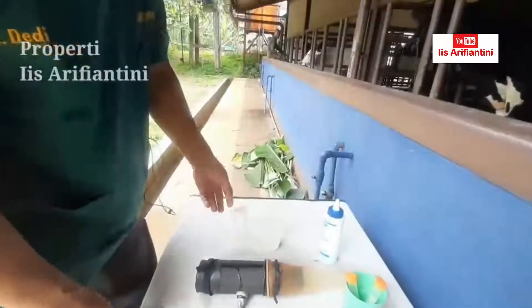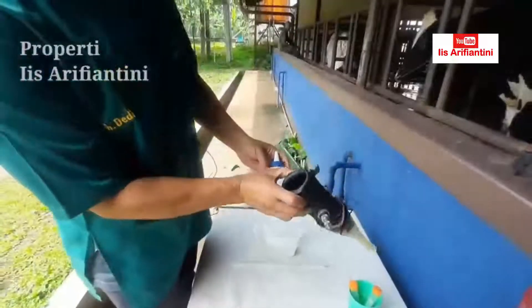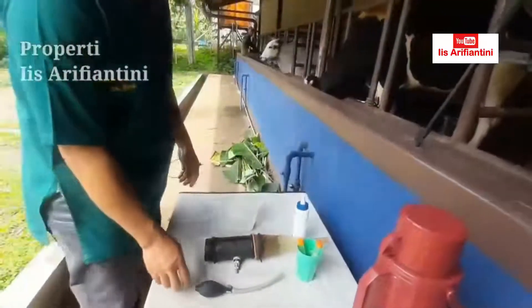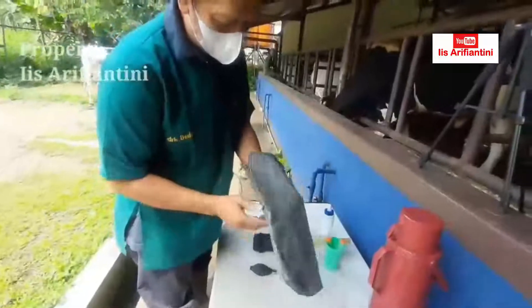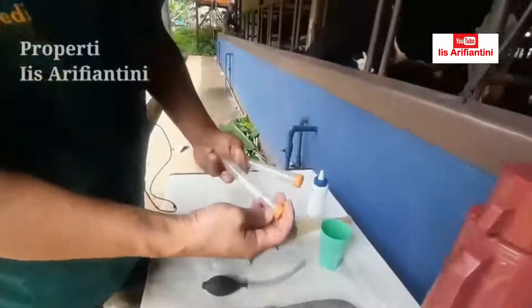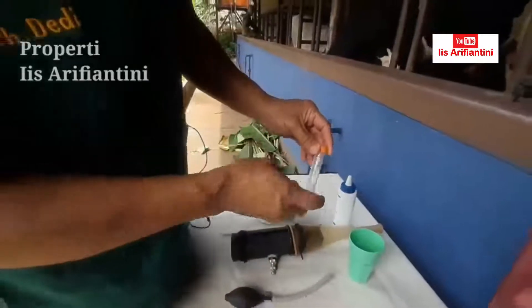This is warm water (air hangat) that we will put into the bag. This is KY jelly to clean and lubricate the bag, sehingga memudahkan penis pejantan masuk ke dalam bagian dalam penetrasi. This is the cover for the collection bag, and this is a scaled collection tube so we can see how much volume of semen we collect.